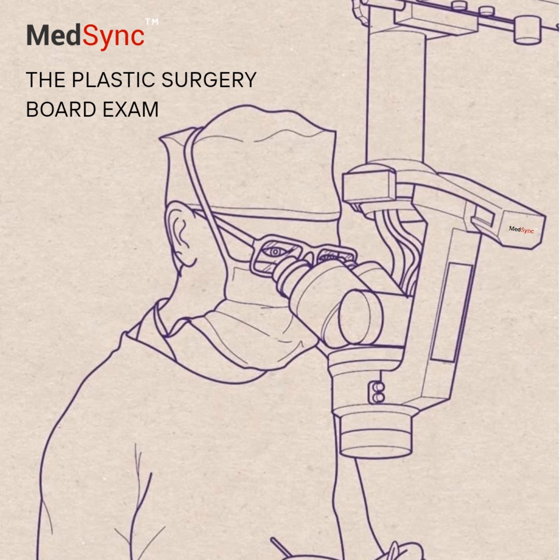Spider veins on the legs. Similar lasers. Yeah. KTP, PDL, Alexandrite, diode, and Nd:YAG is quite common, IPL too. Crucially, you need to address any underlying venous insufficiency first. Right. Laser is more for the superficial fine vessels or perhaps areas prone to ulceration with sclerotherapy, or if someone's allergic to sclerosants. Exactly. And sometimes combining wavelengths like 532 and 1064 nm might give better results.